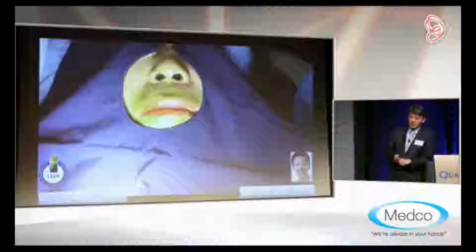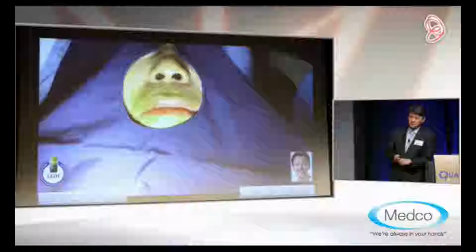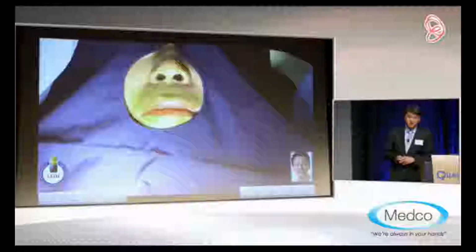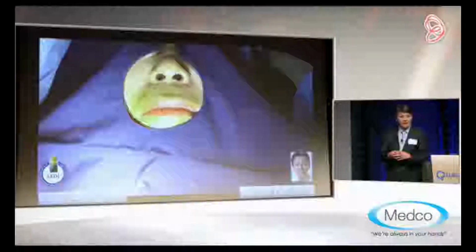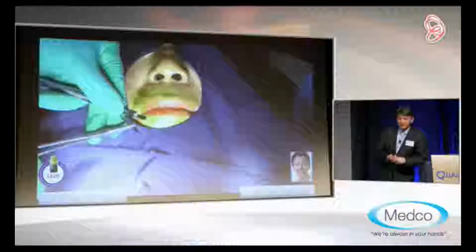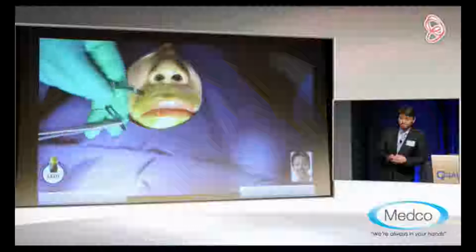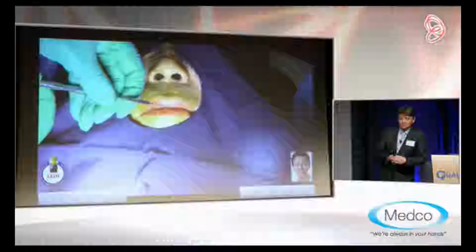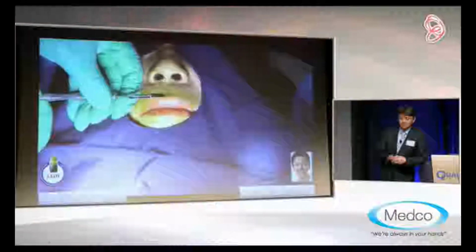Sometimes you want to harvest connective tissue when the patient has a very thin gingiva, then you want to utilize a double blade. These instruments have various angulations to harvest the connective tissue for the tunneling grafting technique. After you use the single blade, as you can see here, we attach an additional blade, and this makes a nice double blade for you.